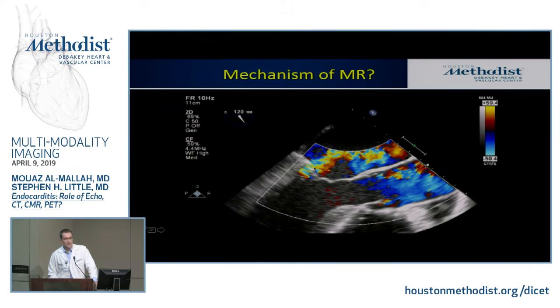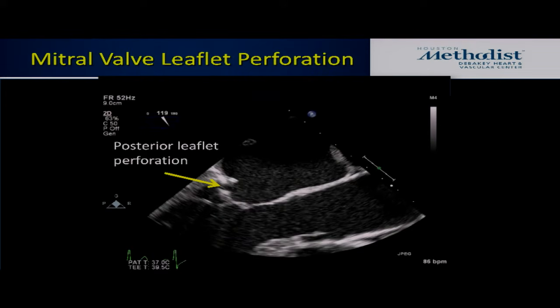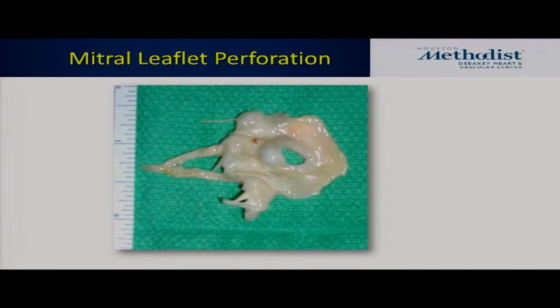So this now we have the association of endocarditis. So we had a funky lesion here that was suspicious. Now we have basically a perforation in the region of the funky lesion. That's endocarditis. Okay, and there it is in a still shot with an arrow to make it easier. Okay, and that's kind of what it looks like, or it can look like.